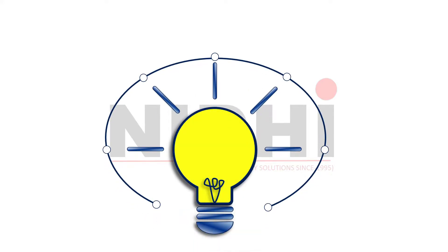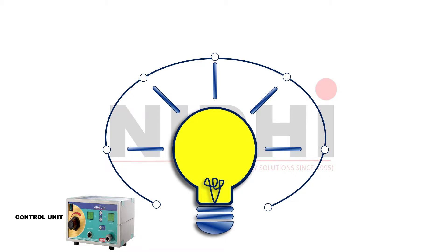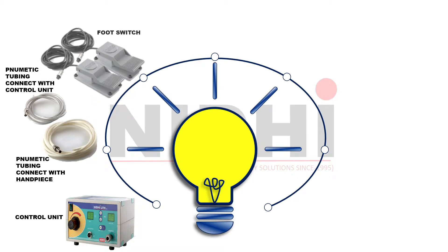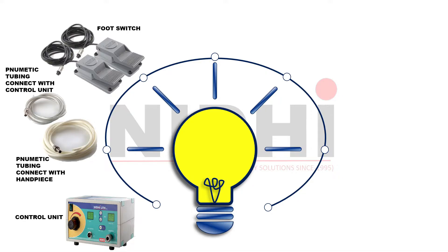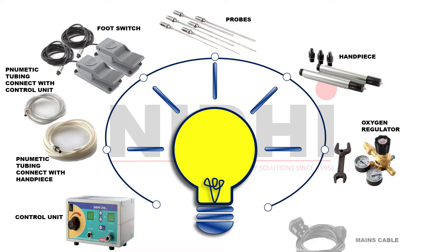Let's take a brief look at what instruments we are getting in the Nidhi Lith Digital Kit. First of all, we are getting the Nidhi Lith Digital Control Unit. Along with it, we have two types of tubing. We have also received two foot switches, but we need only one at a time to operate Nidhi Lith Digital effectively. Then we have six probes of different sizes. We have received two hand pieces — we need only one at a time, the other is a spare. And we have an oxygen regulator and mains cable in our kit.